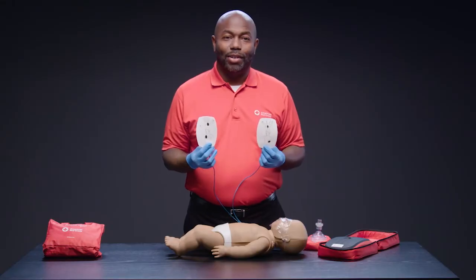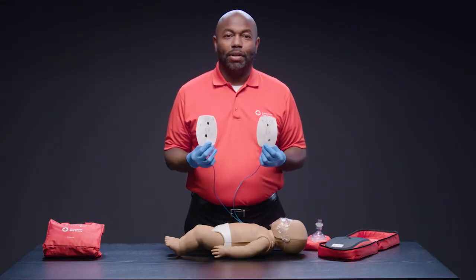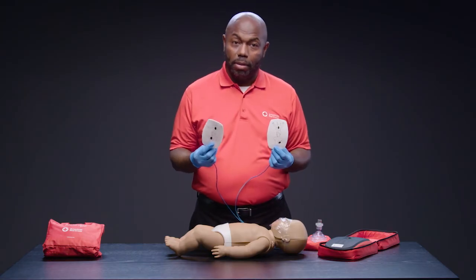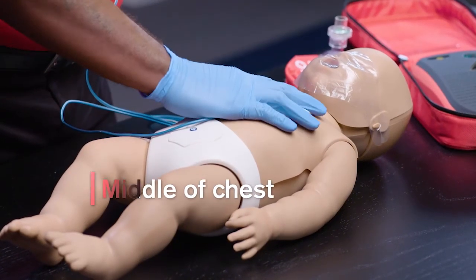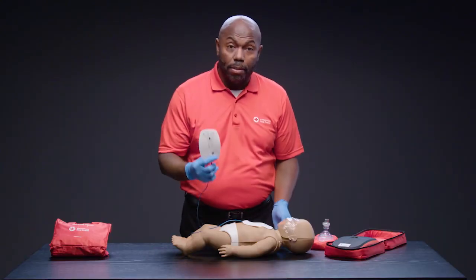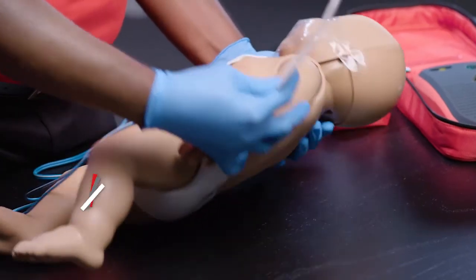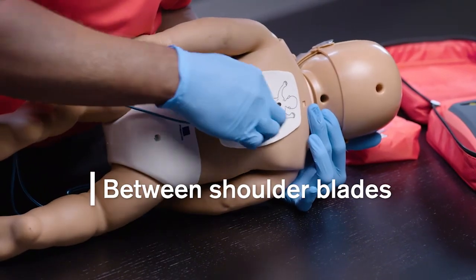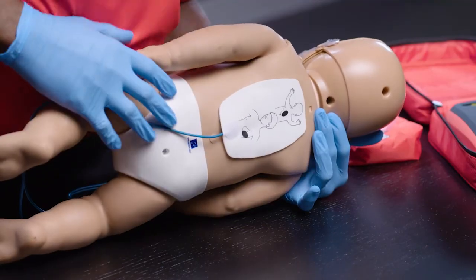When using an AED on an infant, always use the front-back pad placement. Apply one pad in the middle of the infant's chest and the other pad on the infant's back between the shoulder blades, in the middle of the infant's back.